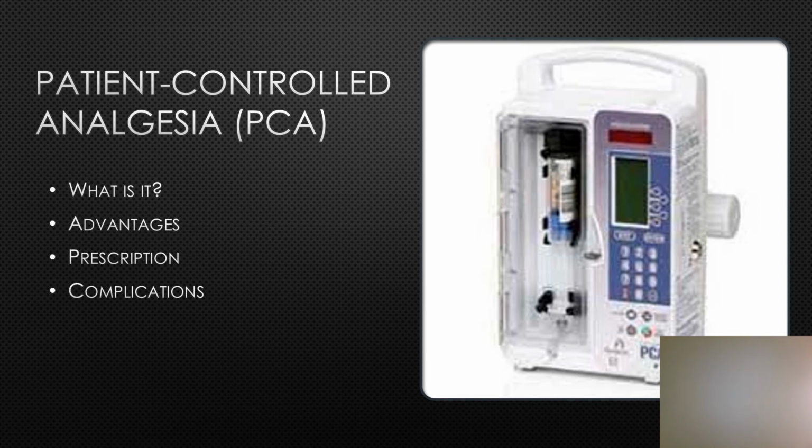Advantages of a PCA include no intramuscular analgesia administration, individualized pain relief, decreased time between pain onset and medication administration. The client has a sense of control, and it helps allow for night sleeping and decreased day drowsiness. In addition to these, clients often will use a lesser amount of analgesia when they administer it themselves.